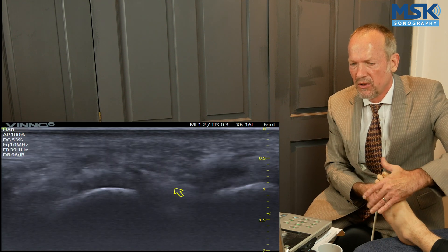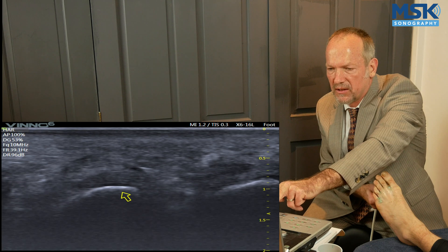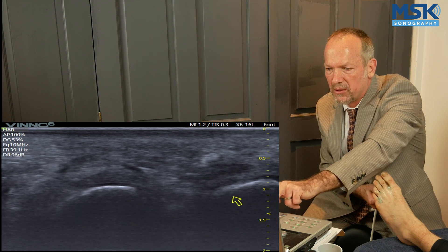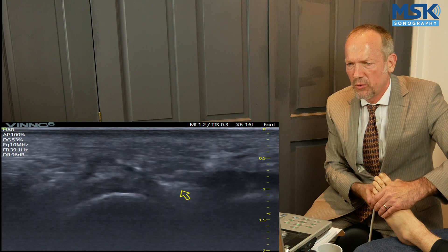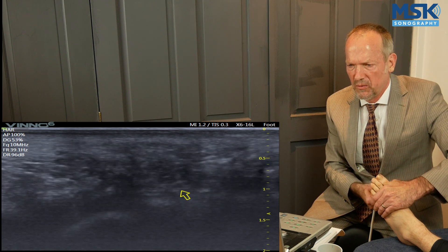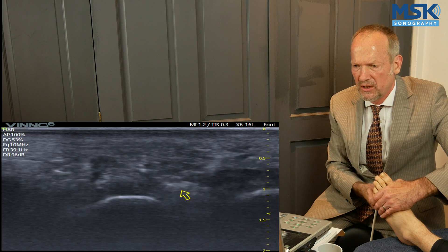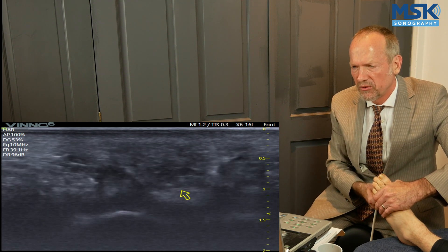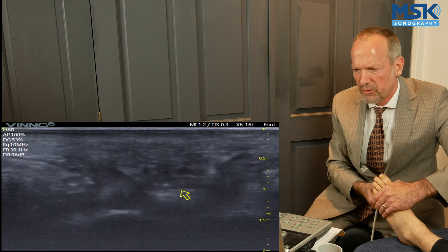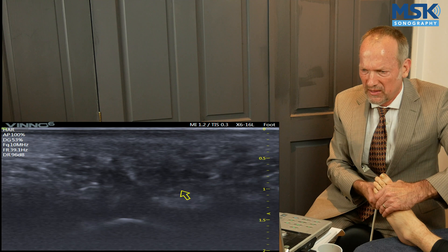Now we're in short axis on the plantar aspect. That being the second metatarsal, that being the third, through the space there. If we squeeze, one can see that there's movement of some tissue there. But with this patient being asymptomatic — there have been some problems with bursal fluid — there is some movement through there, but we do not see any Moulders sign there.